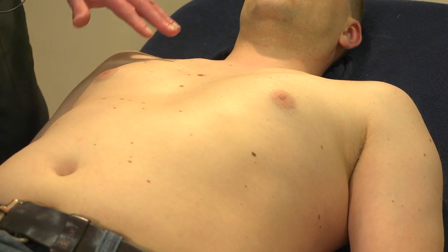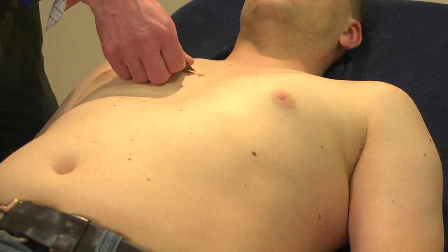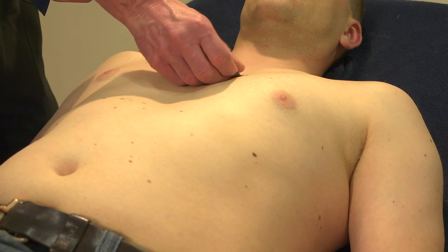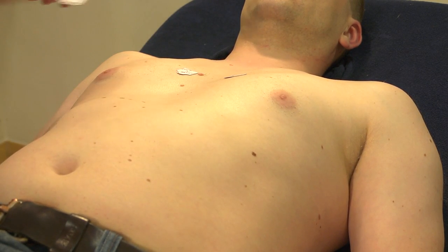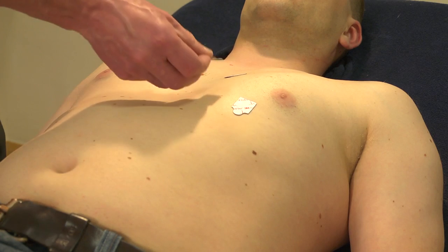For the chest leads — although I've been doing this for years, I always need to look at the chart to see precisely where to put the electrodes. The first one, C1, goes on the fourth intercostal space on the right. The second, C2, goes on the fourth intercostal space on the left of the sternum. C4 goes in the mid-clavicular line one rib down, and C3 goes halfway between those two.